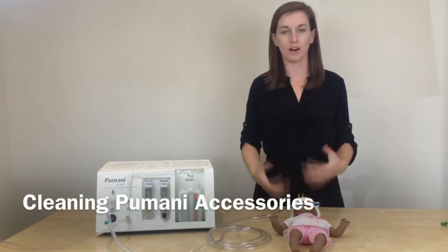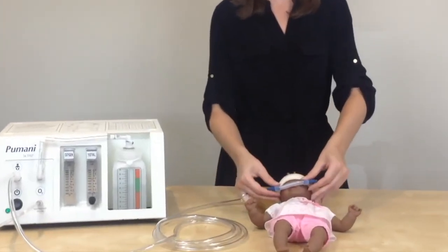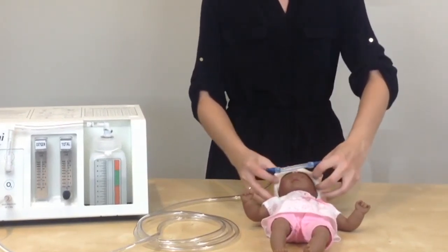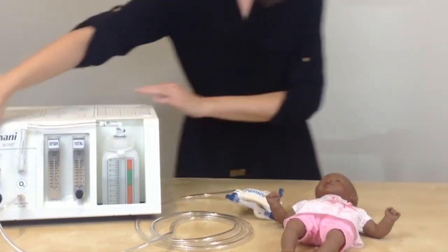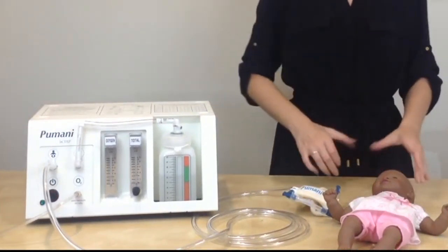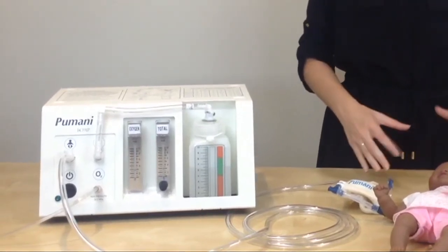When your patient is ready to come off of Pumani treatment, you will first remove the prongs from the patient's nostrils, and you can completely remove the hat, and then you will turn off the unit. If the patient still needs respiratory support, you can place them on oxygen therapy or just regular room air.